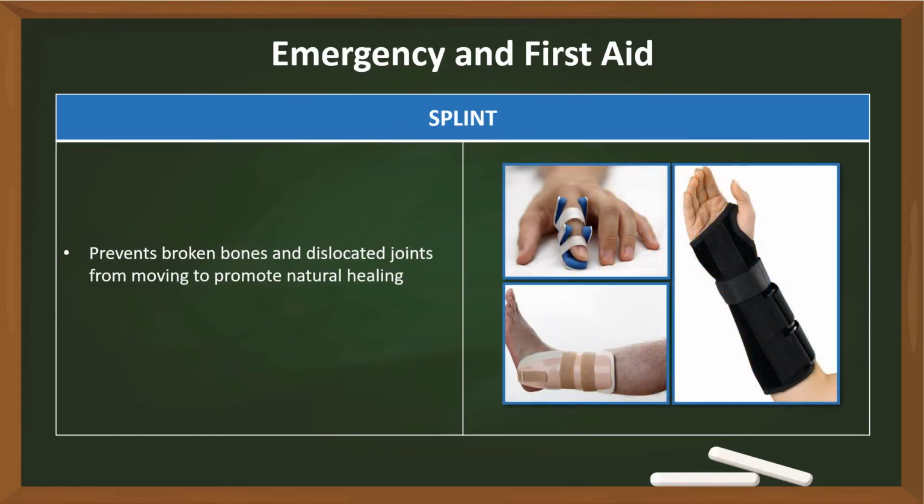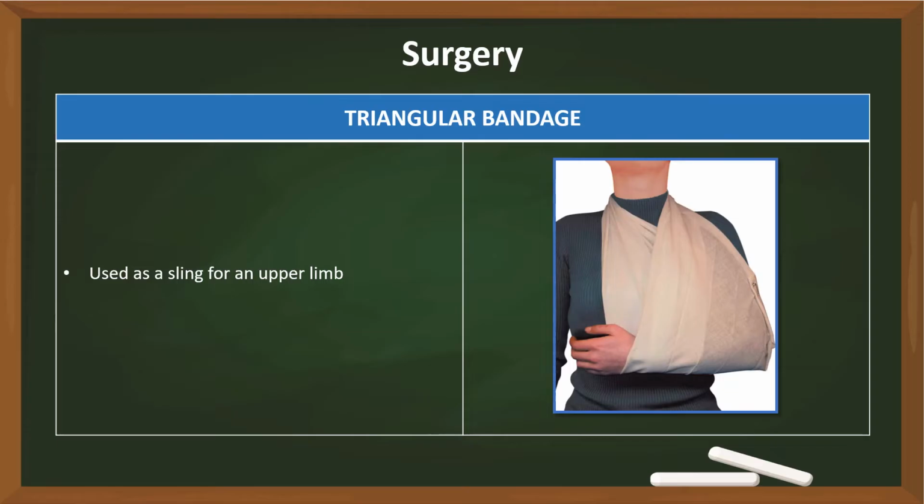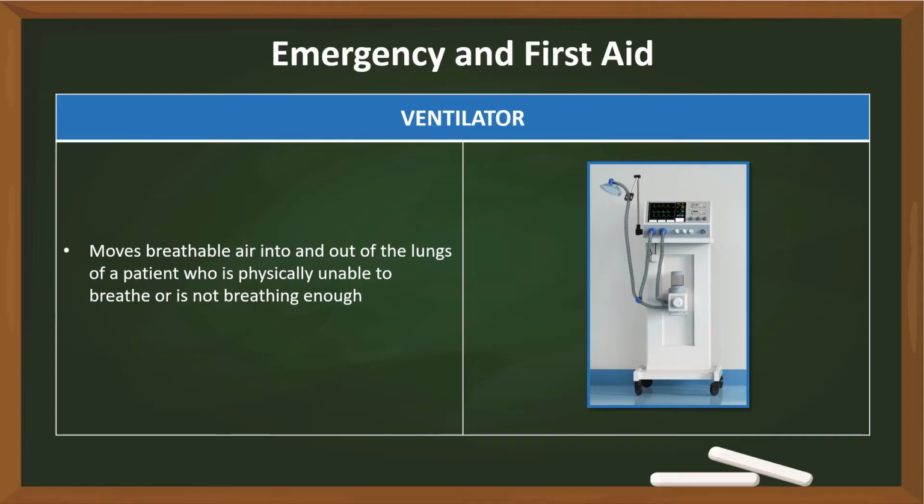Splint. Stretcher. Triangular bandage. Ventilator.